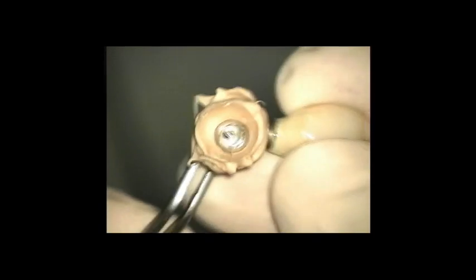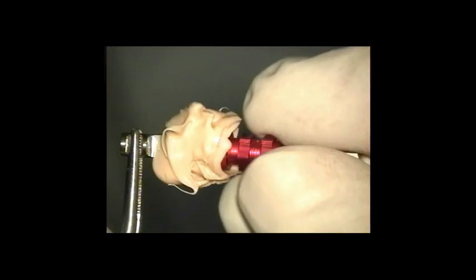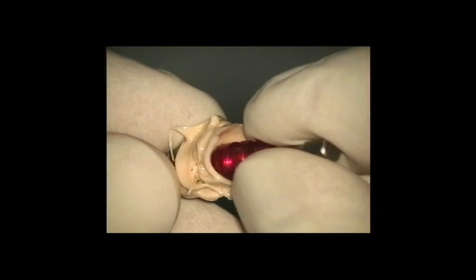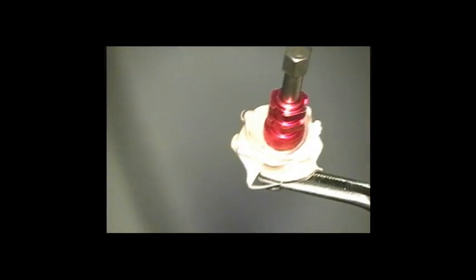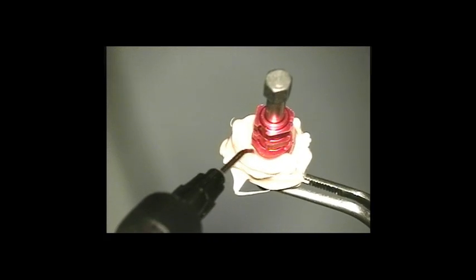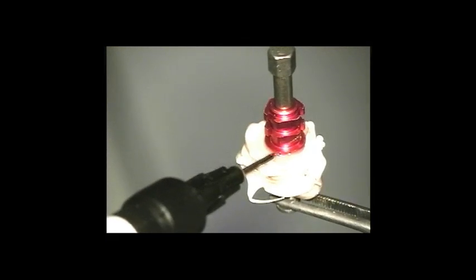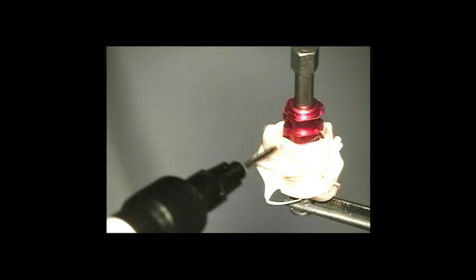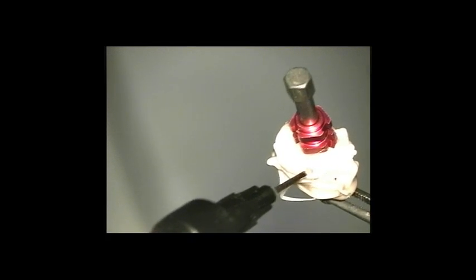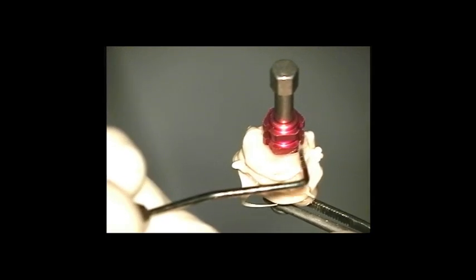So now we unscrew the provisional crown and we have an impression of the provisional crown's contours attached to the analog. We can then screw a transfer onto this. So I'm going to do an open tray impression technique. And we fill the space. The space represents the contour of the provisional crown. We fill that space with flowable composite attached to the analog. And now the transfer has the same contours as our provisional crown.